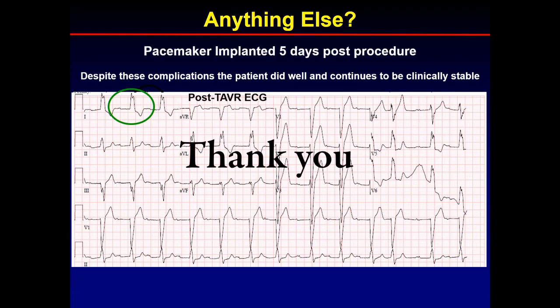Can you make any comments about how you adjust for measurements? So there's one paper, I think, in the European Heart Journal of Cardiovascular Interventions by Philipp Rühle, and at that time we compared a respiratory ECG-gated non-contrast MRA versus CT. I think what you have to keep in mind, first of all, is that those respiratory-gated acquisitions are a true volume. It's somewhat a temporal average, but most often diastolic.